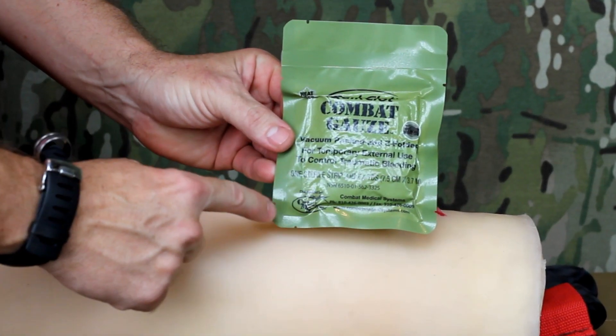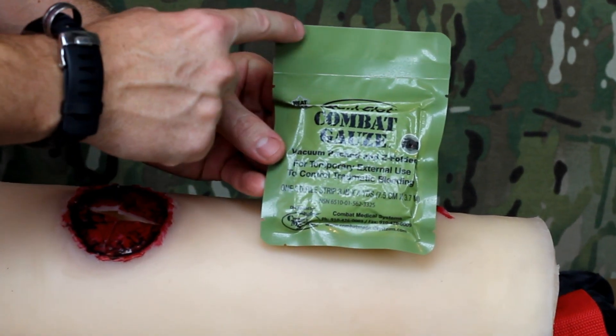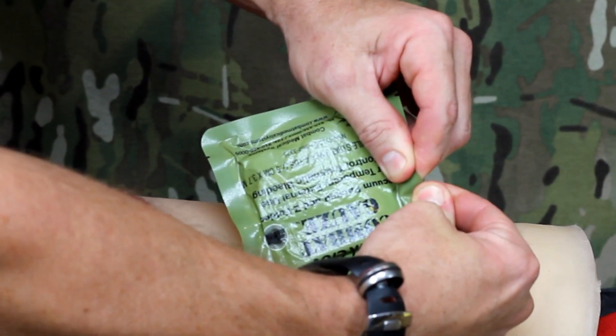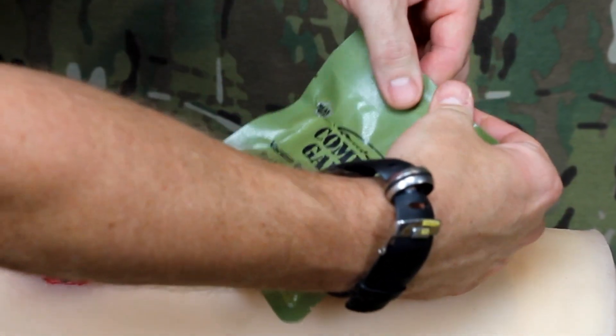There are six tear points located around the edge of the packaging. It is important to use these points when opening, as it is difficult or impossible to tear the package otherwise.